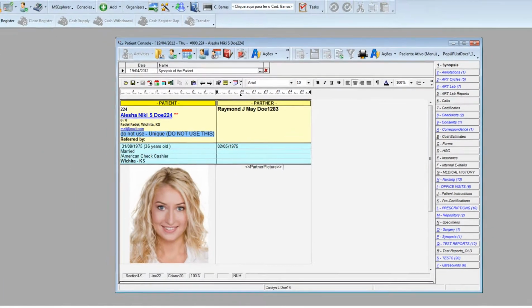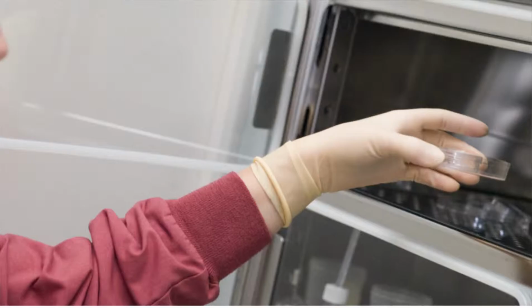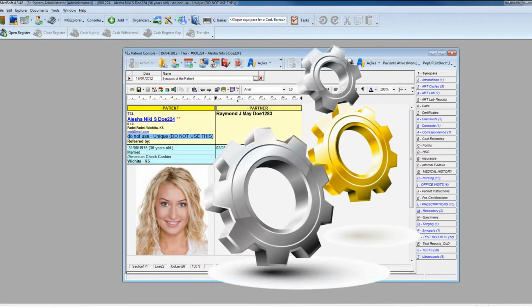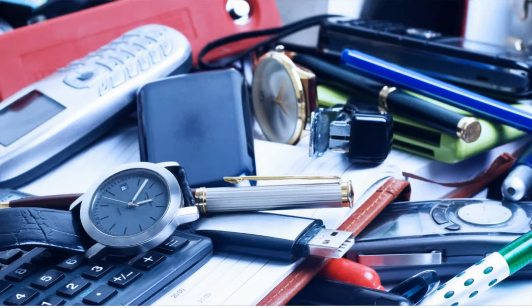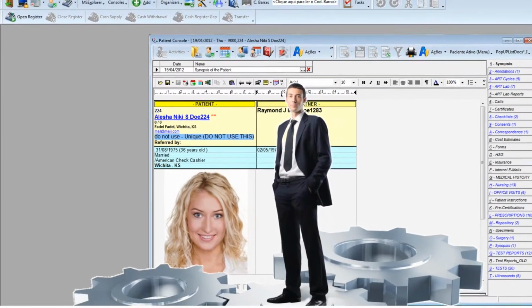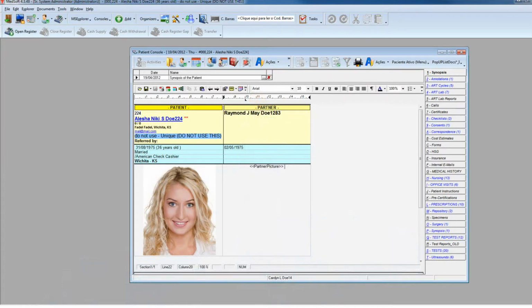Have in mind that Medsoft was made for you, who wants to control everything, even the incubator racks where the embryos are being cultivated, and Medsoft is great for you who wants a more straightforward system and doesn't want to be a slave of complex routines that don't allow you to move on until you come up with data that is not interesting for your services and daily practice. In summary, you have a system to control your process, and not a system that tells you how to control a process.